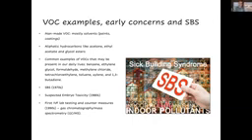So this was very stressful for the early embryologists, and suspected incidences had involved paints and glues and repairs of roadways surrounding the embryology lab. And usually those incidents occurred because the spillage of these compounds occurred very close to the laboratory air inlet.